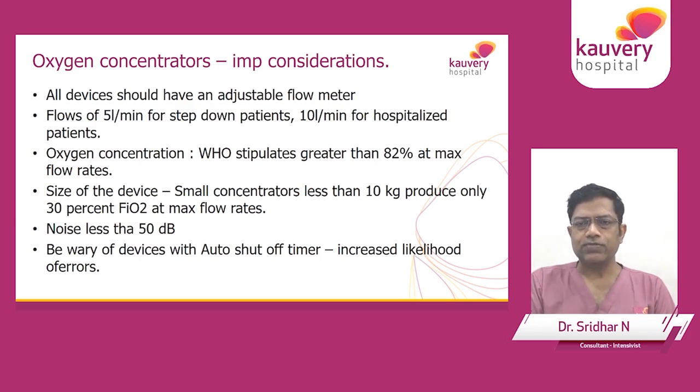The oxygen concentrators for 10 liters per minute are much more useful for hospitalized patients. So they come in, you're struggling to find a place to put them, any bed with or without oxygen. All you need is a plug point, a portable pulse oximeter, and a nurse that's going to go around and check their saturations regularly. Use a 10 liters per minute one, connect them to the non-rebreathing mask, watch their oxygen saturations, and titrate the flow up and down to maintain saturations of around 90, while at the same time minimizing the amount of oxygen that you're using.